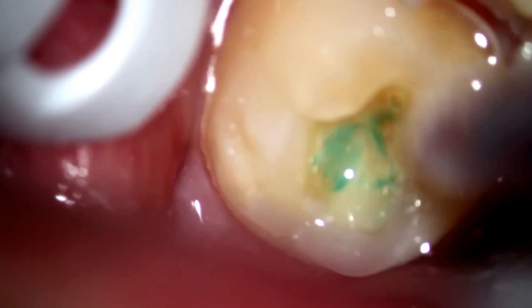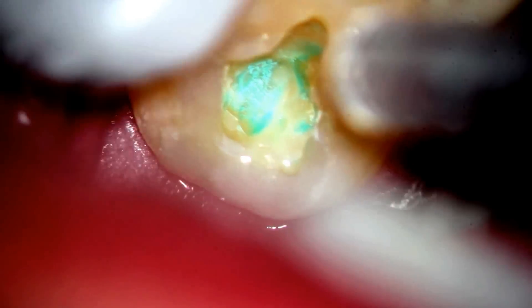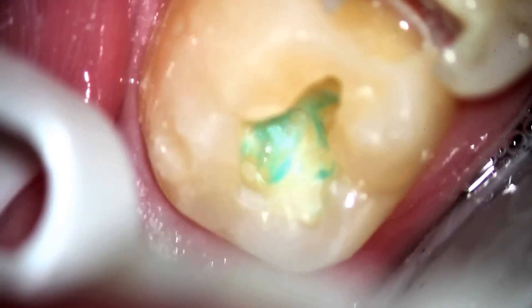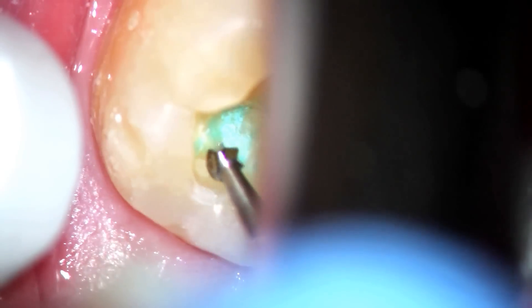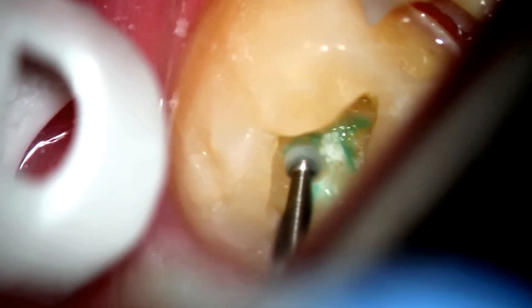Here we are opening that up a little bit, and we still have a significant amount of decay there. The whole idea is to remove it all. You're just getting the highlights of this particular procedure — it certainly took longer than ten minutes to get this all cleaned up.